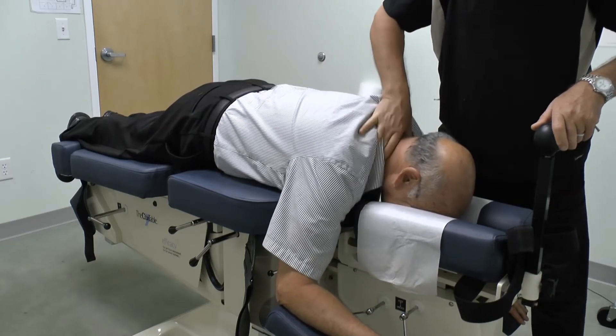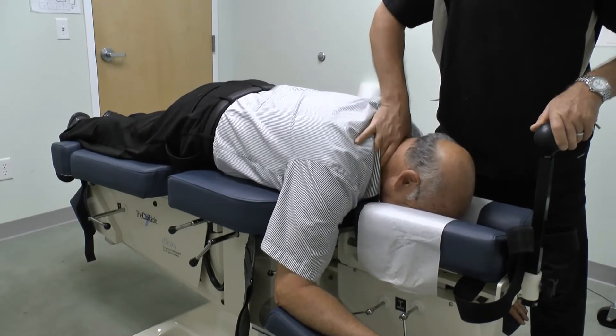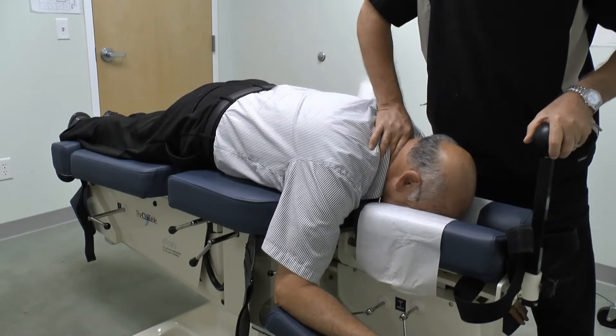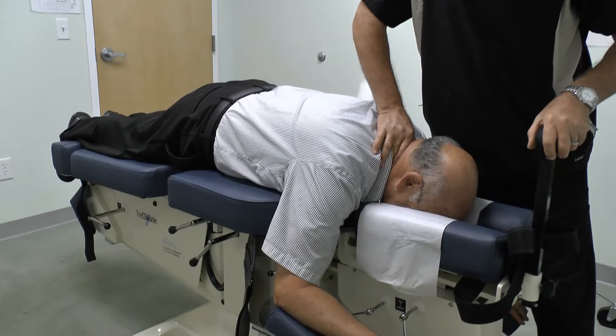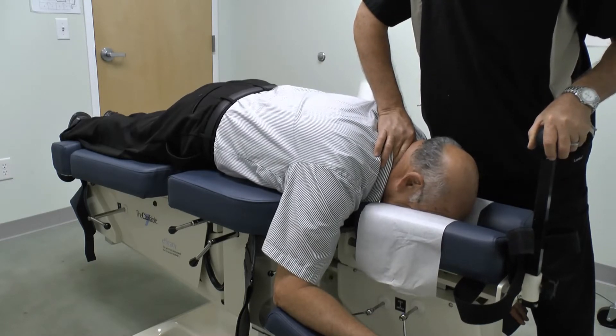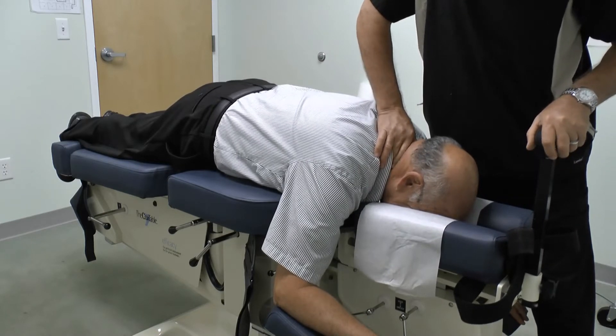This is Cox Flexion Distraction Technique performed on the cervical spine, protocol two, starting with ten repetitions of long y-axis. If you feel any discomfort at all, you'll tell me, alright? I will.